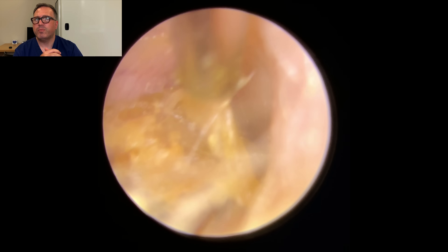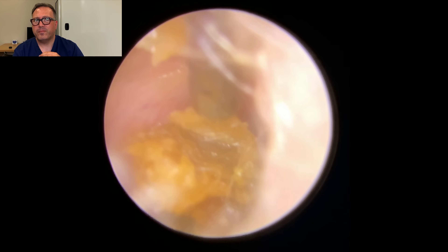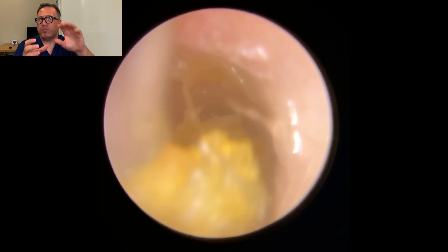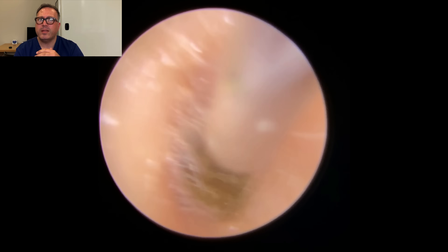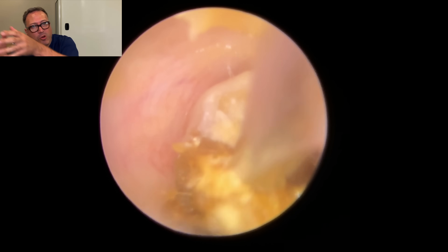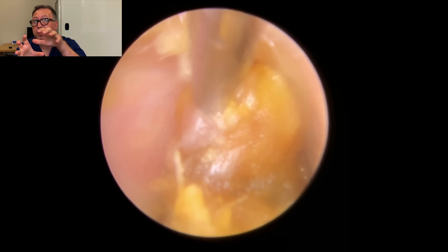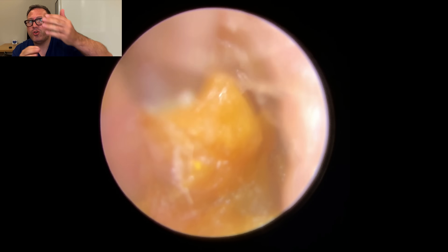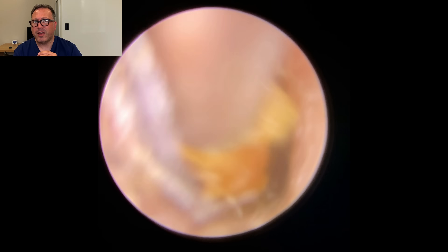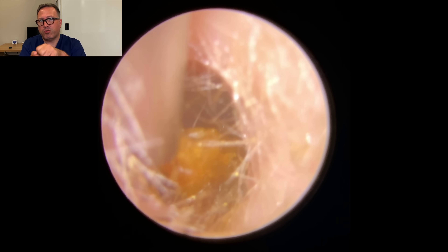Let's see if we can roll this now and bring it towards the endoscope. You can see just freeing it up, gently rolling it — you can see the back end of the wax just start to lift up there. Trying to aim for the softer material that's been against the canal wall. We've just unpicked this little extra section here at the front — that's come away now. Now as we pull down, you can see that whiter, fresher skin material coming over the top — that's great to get a grip on because it tends to be much tougher material. You can see we've actually turned the wax — we've flipped it end on end — and it's just working its way down the canal. If we can get a strong enough piece to come through, I can switch tools and use the crocodile forceps to pull it the rest of the way.